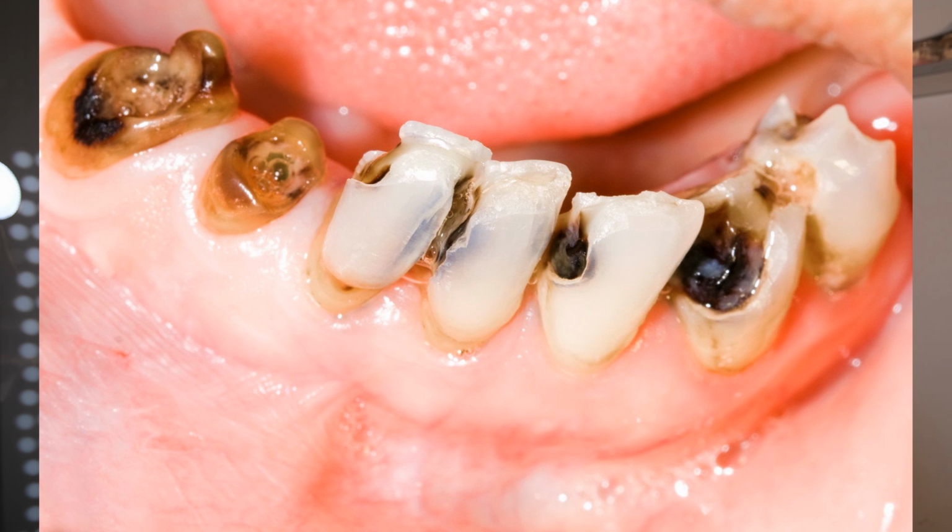To treat the cavity that has been formed from bacteria and caries, the dentist still needs to do the drill and fill technique. For now, there's still no drill-and-heal one. So today we're going to talk about dental fillings and how we fill those holes that have developed from bacterial infestation and bacterial infection, and what type of material we can use there.